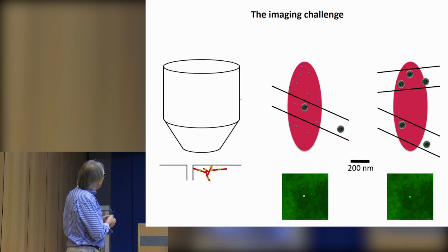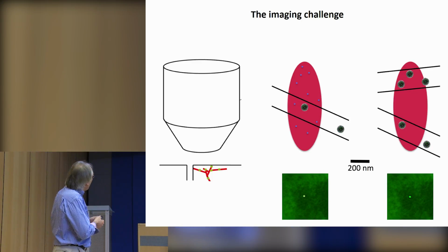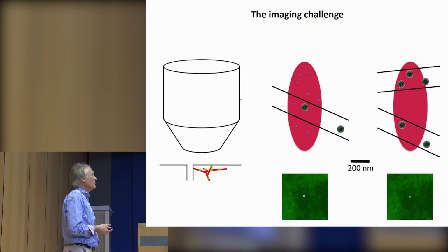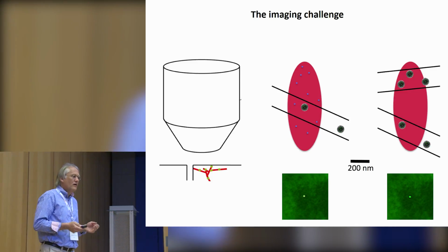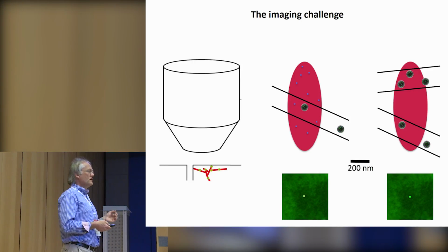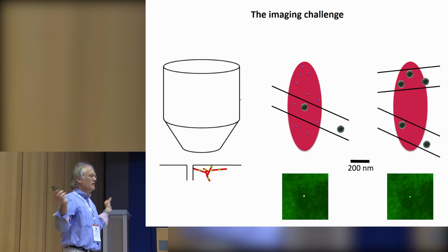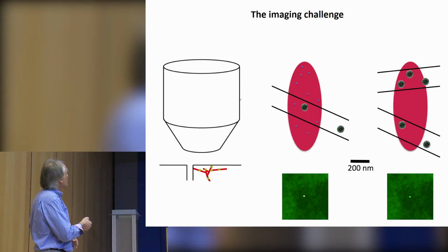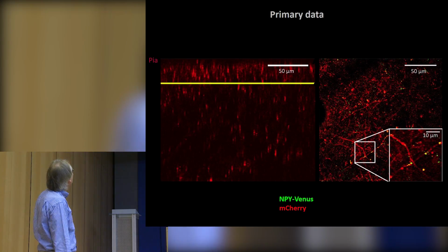Now, if you have this situation, let's say multiple axons running through that focal volume, then, of course, the signal would be maybe a bit brighter, but you cannot discriminate that these are 2 axons. Yeah? So this would be the problem that we face with this imaging approach. And knowing this, we deliberately generated a situation where we have only very few labeled axons, so that there's a lot of distance between individual axons, so that we don't run into this problem, but that we can assume that this is our imaging situation.